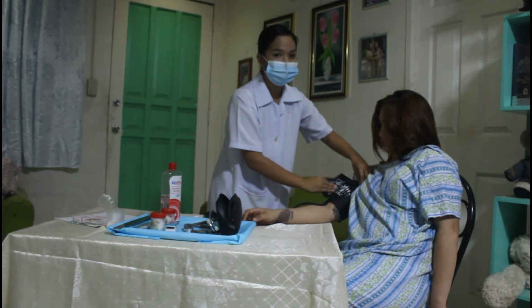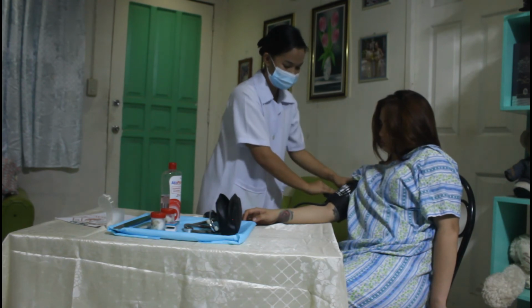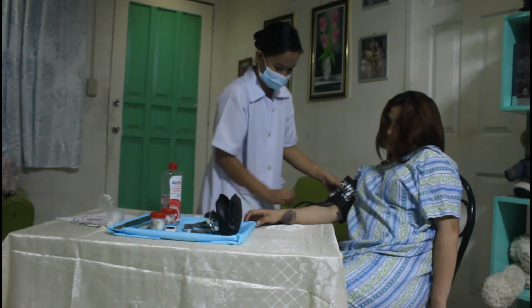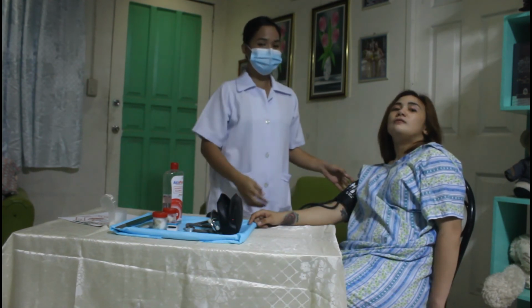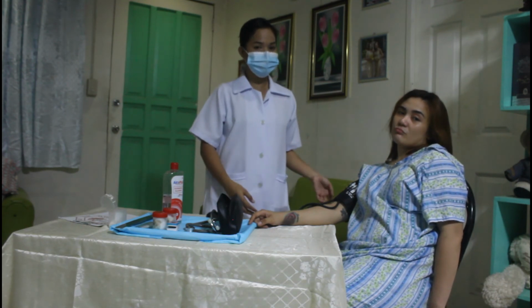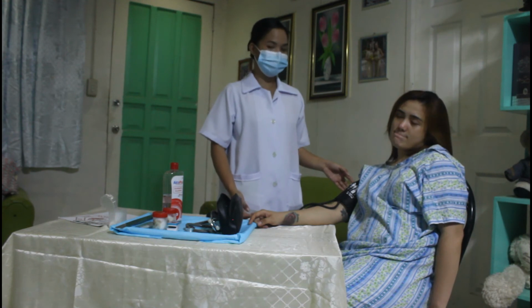So ensure proper cuff application because tight clothing causes congestion of blood and can falsely elevate blood pressure reading.